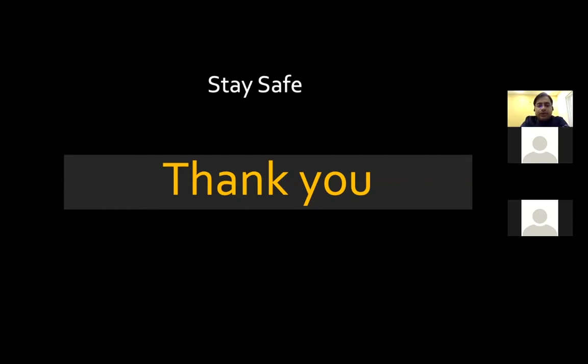Dr. Vinay Shukla, what happens is that if I am an operating surgeon and somebody is standing right in front of me, the things that I am seeing through laparoscopy, the exact mirror of it is seen by a person who's standing in front of me and looking at a screen behind me. So if I see a structure at right, the same structure will be seen at the left for my assistant standing opposite to me. If I want the assistant to move the instrument right, then he actually moves it left. So this is the kind of jugglery that happens with the assistant.